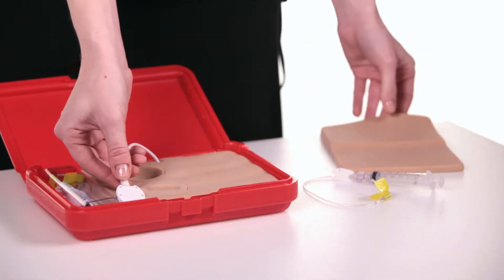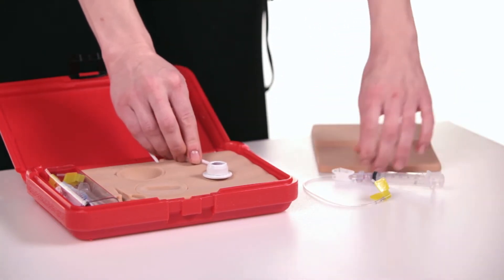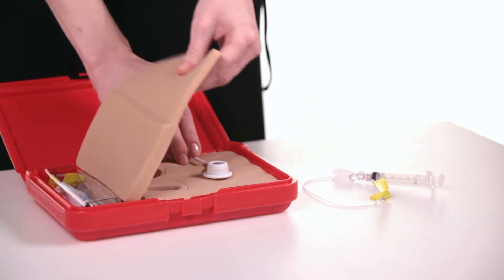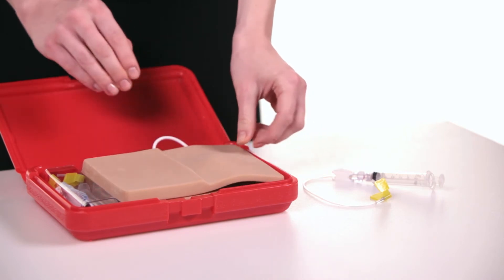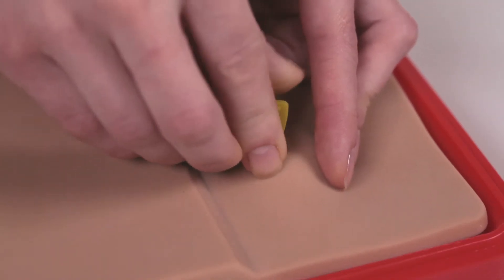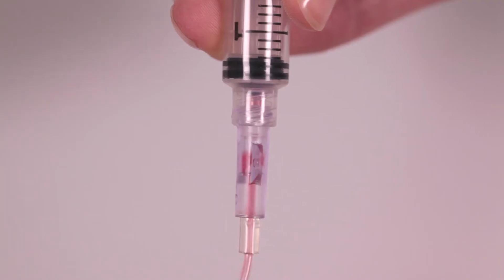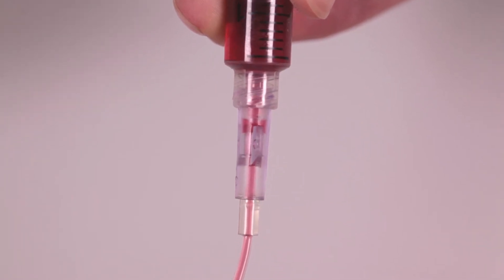The supplied port is removed from the storage area and placed on the underlying soft tissue block. The skin flap is placed over the port and the port can be palpated. The supplied right angle Huber needle is used to access the port and successful access is confirmed by observing a blood return when pulling back on the syringe.